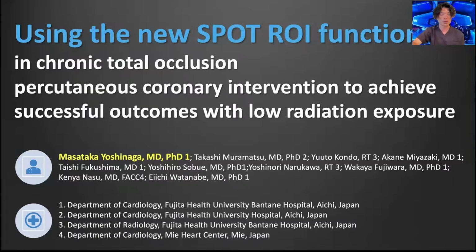In this presentation, I will demonstrate our technique for minimizing radiation exposure during chronic total occlusion percutaneous coronary intervention by using the novel SPOT ROI function. I hope this video will provide helpful tips and practice insights, especially for those interested in advanced CTO PCI procedures and radiation safety. Let's get started.